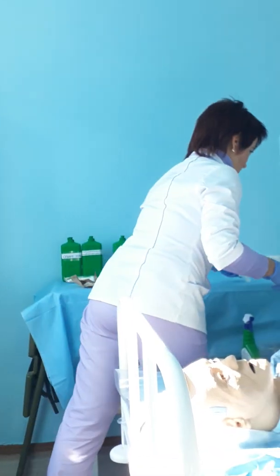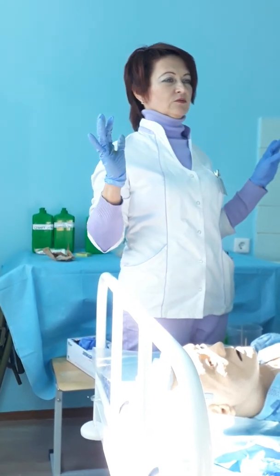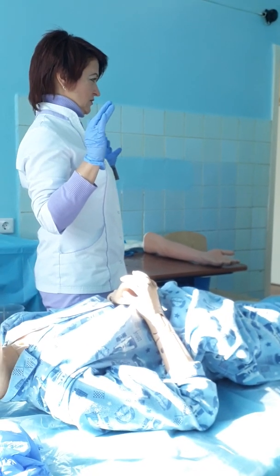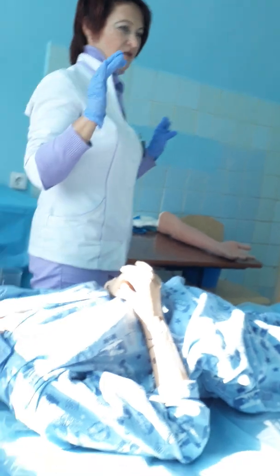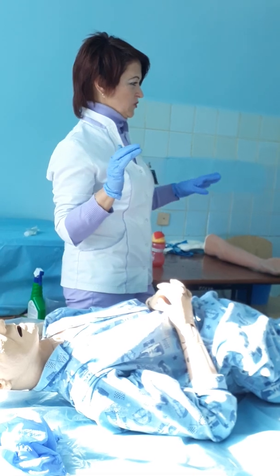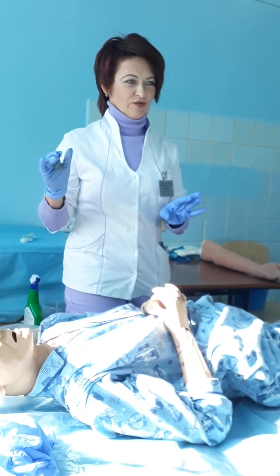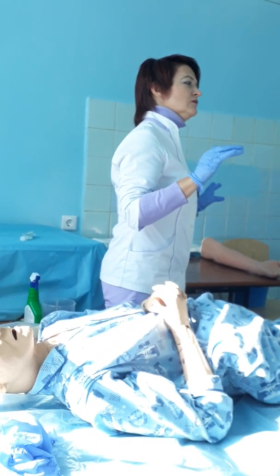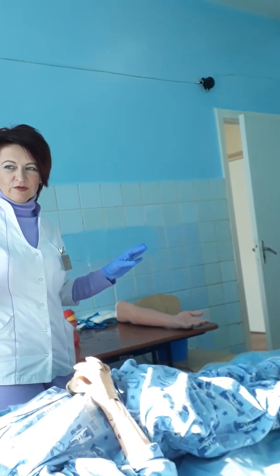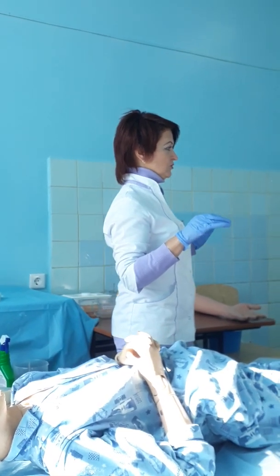Afterwards, you start to work with your patient. How will you do it? Hello, how are you? Okay. After that, make sure who your patient is, what is your name, and explain what you will do. Now I will get your solution with medicine. Did you have this injection before? Do you have allergies? Do you have an allergic reaction? Okay.